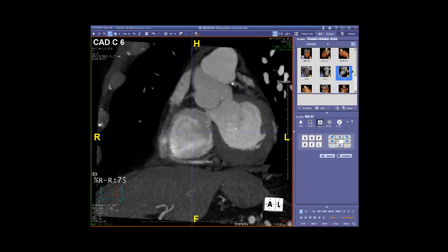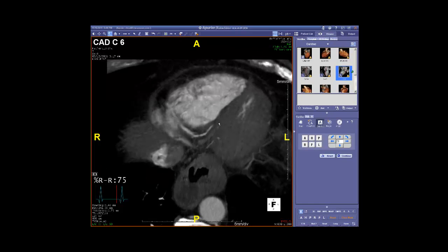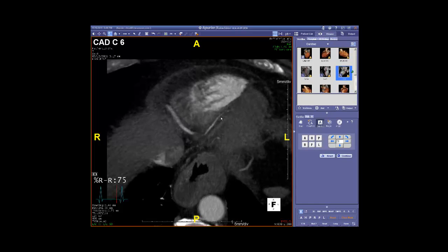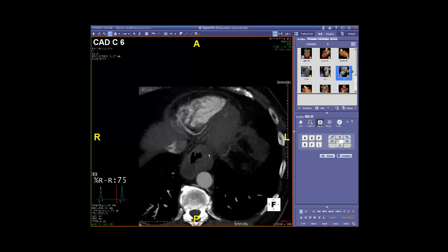It's possible that with other reconstructions we might find this to be a normal vessel, but in this particular reconstruction we really can't say whether there's additional disease here. Moving further down to the distal vessel, the motion there is not as much of a problem, and we can see the posterior descending artery extending down here in the inferior septal wall — so the distal right coronary looks pretty free of disease. I'd like to again point out this large hiatal hernia: the stomach is bulging up alongside the aorta and the thoracic spine — another potential source of chest pain. However, the circumflex vessel certainly appears to be a cause of the patient's symptoms, and regardless of the distal right coronary interpretation, this patient needed to be admitted and undergo a coronary angiogram.